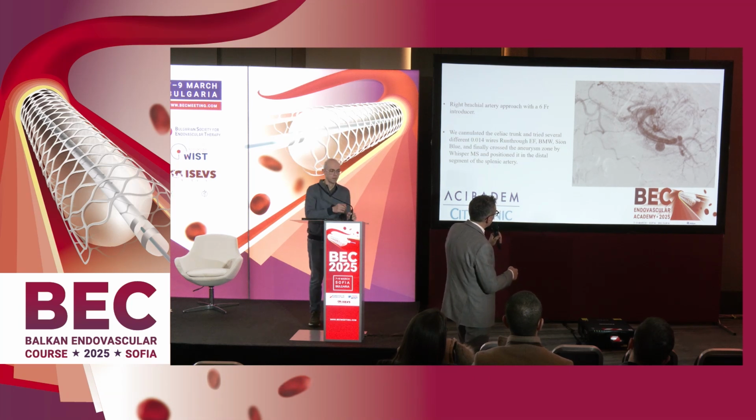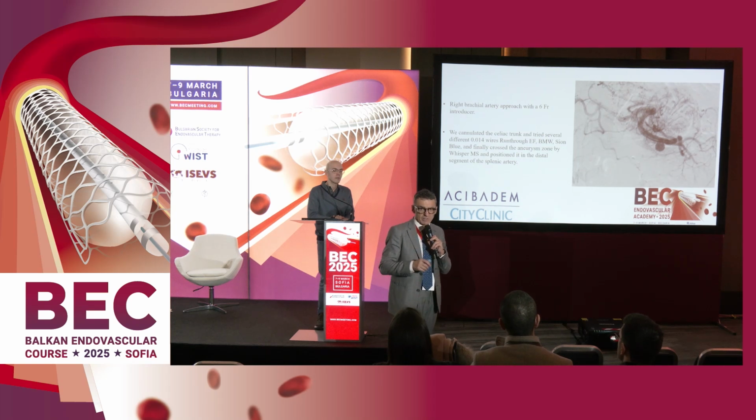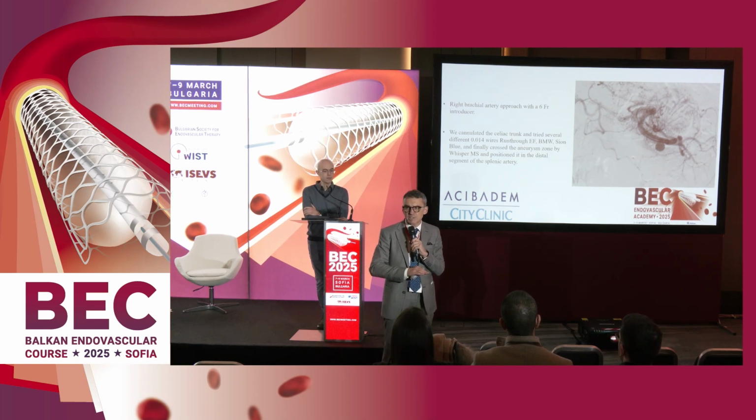We have a publication of more than 1,500 brachial approaches. So there is, let's say, the legend of the dangerous brachial artery. In fact, it was true in the past. In the past, the endovascular procedures were done with 7, 8, 9 French sheaths. Nowadays, we are performing 99.9% of all the procedures with 5 and 6 French. Because of that, the brachial artery is an extremely safe access, extremely safe.